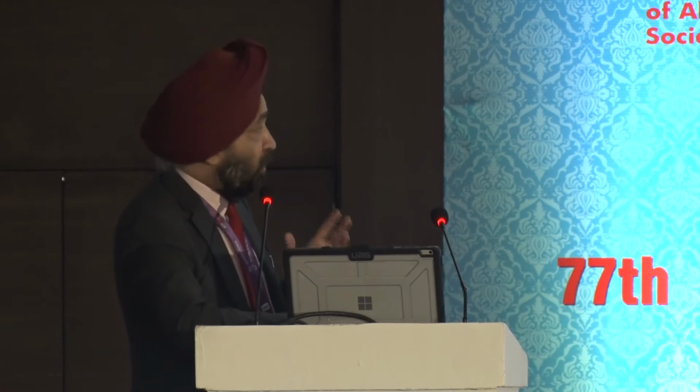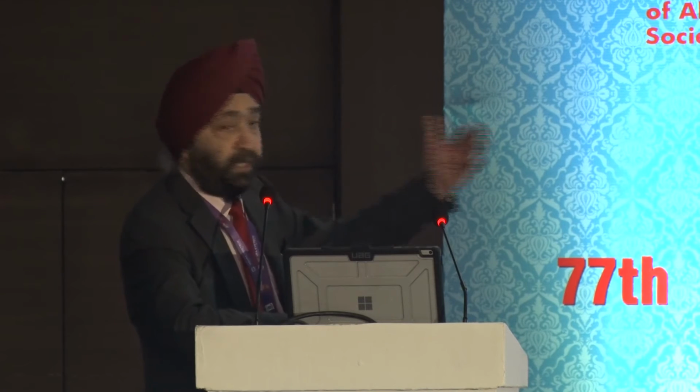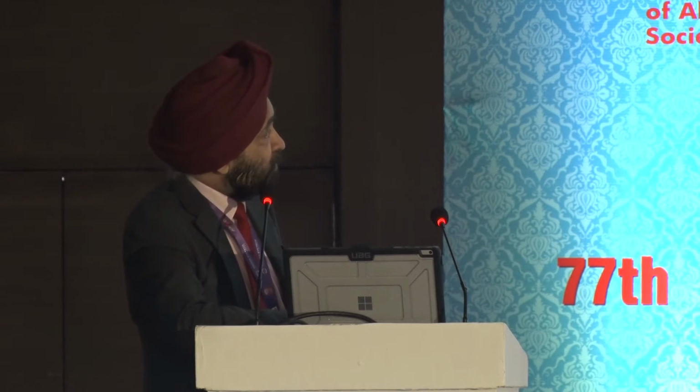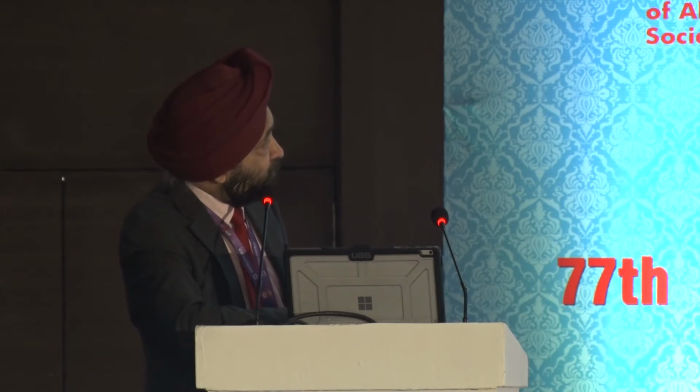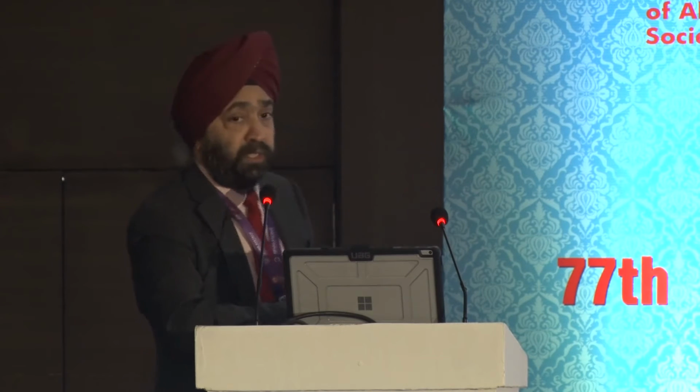So you are actually bypassing the diffraction of the light from the corneal opacity, because it's not the microscope light passing through the cornea and then going back to the retina. It is going straight to the retina, and once it is going to the retina, you can see that this is a great outcome that you can have. This is the epinucleus that was removed. Now you can see the cortex that is being removed, and now you can see that this is the IOL that is being implanted. And look at the beautiful glow that you are getting in this particular case.